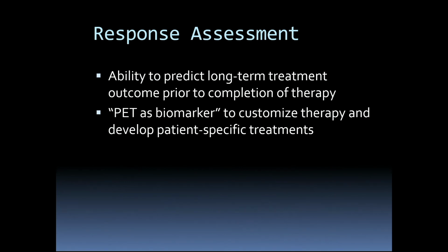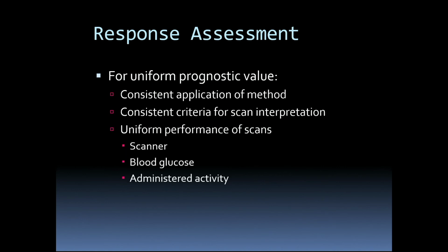So the concept that we're trying to aim for is really for PET as a biomarker, using it like we do other sorts of markers. We're used to seeing histologic markers and serum markers in helping patients decide which therapy to get. Well, imaging can also be a biomarker in a sense, being a way to interrogate the biology of a particular tumor, helping us to decide what the best course of therapy will be.